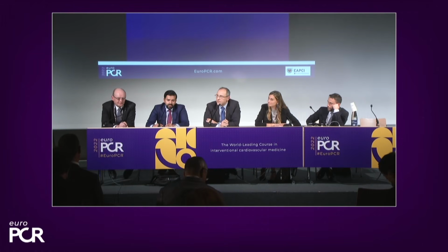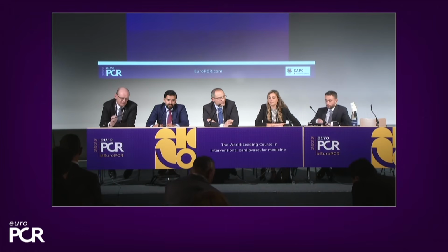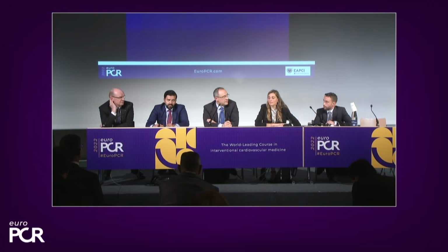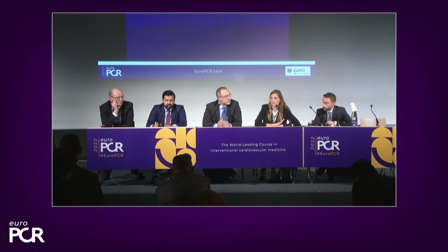Then there is a second aspect I'd like to discuss. We never end a stenting procedure in such a calcified lesion setting just with stenting. We always tend to do some additional post-dilatation. There might be opinions on what is the best balloon to use to post-dilate stenting in this kind of setting. Any preference here? We heard they use non-compliant balloons. I don't know if we have a different attitude here in the panel. Valeria, perhaps? Yeah, I do agree with non-compliant balloon. I think what's important is that you have to check your final result after that, so you actually achieve the best stent optimization. We'll come back to this.